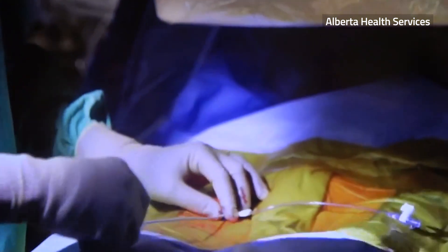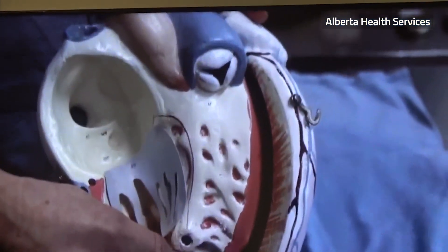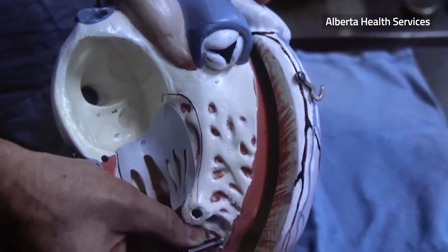It was a little cut down in my groin area. No incisions up here, nothing up here at all, no lead. So insert down there, and it goes up through my groin and into my heart, and then these little prongs came out — I was asleep. A twist and a half into my heart, and it sits in the base of my heart, and I don't know it's there.